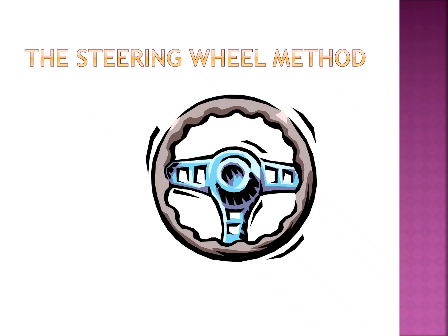So when I'm looking to figure out which bundle branch block I have, I think about the steering wheel method. There's this thing to the left side of our steering wheel that if you click up, it turns on this little light on the outside of your car and it blinks. If you push up, it blinks the right little blinker. I know it's probably not something that you're familiar with driving on the streets, that you don't see too many people using it, but just go with me here a second.